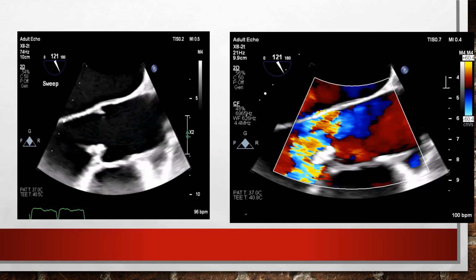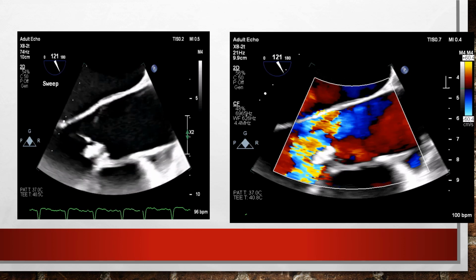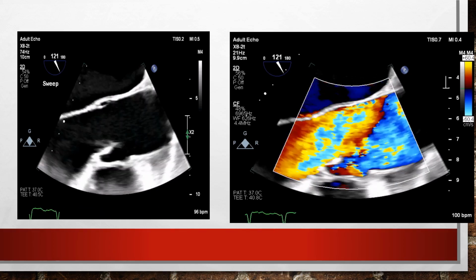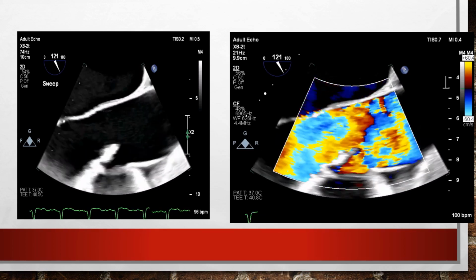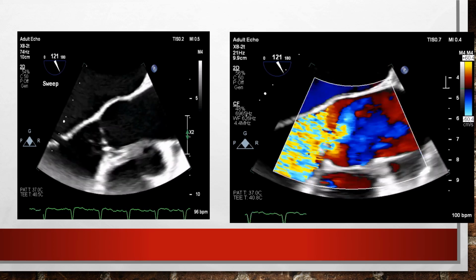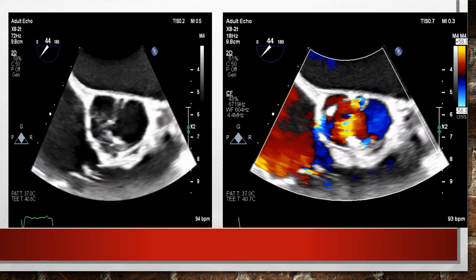This is the transesophageal echo, and this is a sweep, and as you can see, there is clear vegetation on the anterior aortic leaflet, and this is one, and there are smaller ones there. When you put color, you can see that there is a clear jet directed against the septum. But what you can identify here, there is no clear thickening of the aortic root compared to that previous patient. This is short axis, and then we can confirm the presence of bicuspid aortic valve.